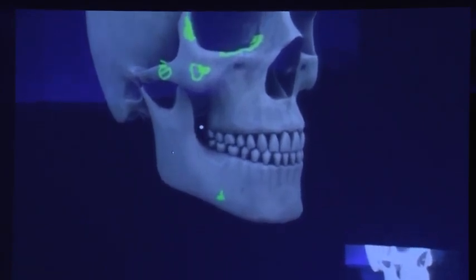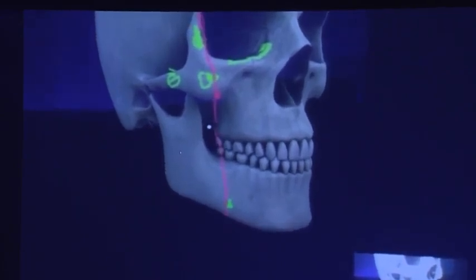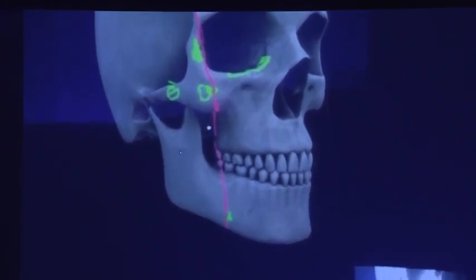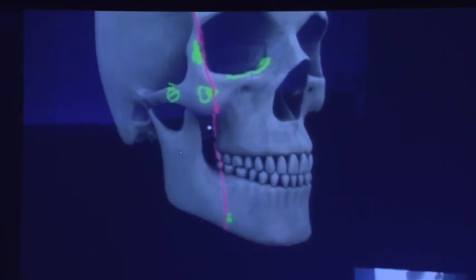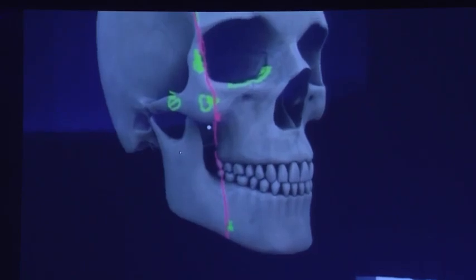If I join this with a line, this is my plane of differentiation. Right. In red, you're gonna see it now, there. Okay, so everything that is medial to there is good for volume. Everything that is lateral is good for lifting. And now tell me what technique are you doing and I will try to follow up.